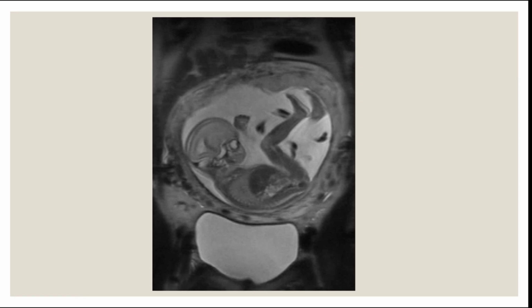What could it be? Okay, guys, guess something. Okay. This is the urinary bladder, which is filled with urine.